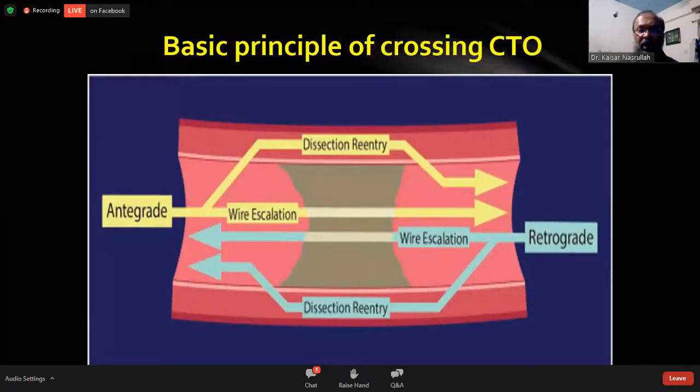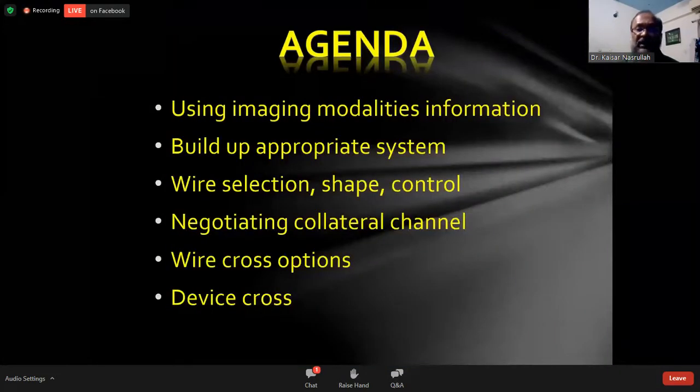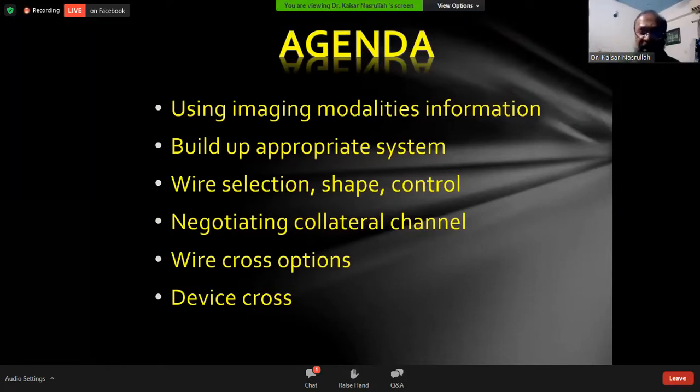So the basic principle of crossing a CTO is very simple. You have to connect the proximal lumen and the true lumen. And there are only two methods. One is true to true lumen by wire escalation, or going through the subintimal space by dissection and re-entry. If you understand this basic principle, it will be easier to do a CTO. So my agenda today is as follows. Let's take one by one.